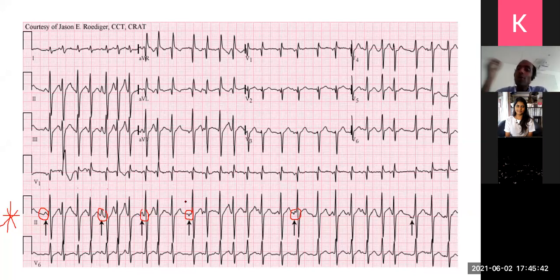So here you can see the definition of an atrial rhythm is abnormal P, normal QRS. Here you can see several abnormal Ps. I will draw what is happening here. ECG is hard to teach like this. If you have any questions, please ask. I would normally draw this big on an ordinary whiteboard, but it's very difficult on this.